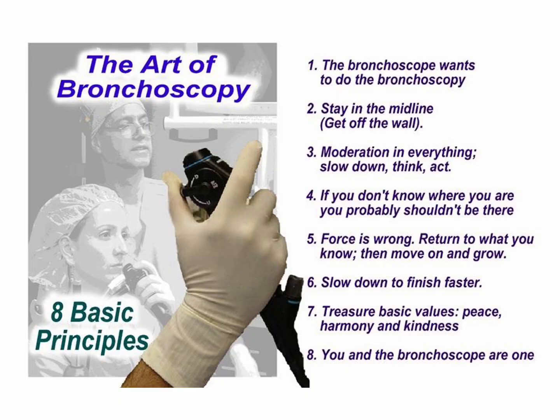Conventional transbronchial needle aspiration remains an elegant example of minimally invasive diagnosis. Despite remarkable advances in endobronchial ultrasound and other imaging technologies, conventional TBNA continues to offer excellent diagnostic performance when performed thoughtfully and systematically. It resides among the fundamentals of flexible bronchoscopy practice.